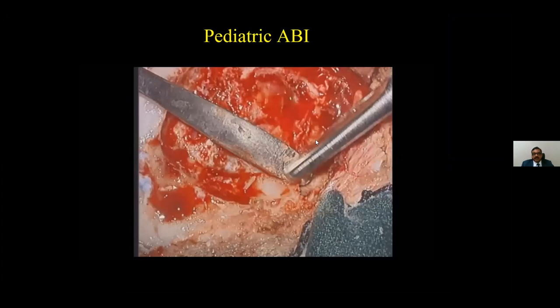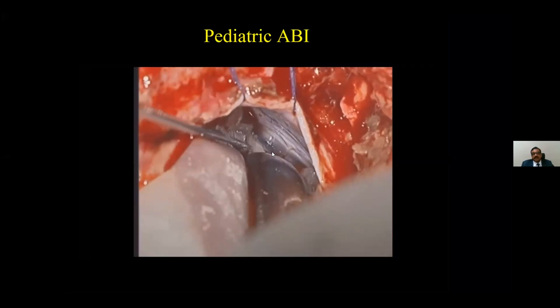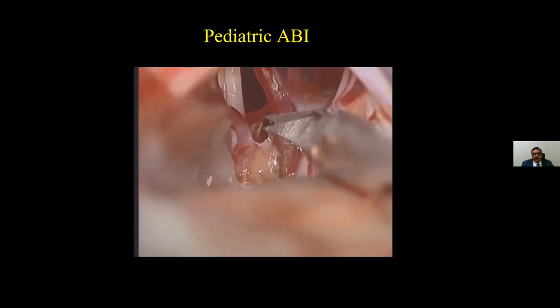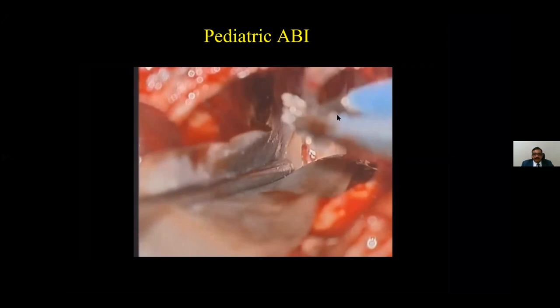And we open the dura, let out the CSF. We open the cisterns and allow the CSF to flow. And the moment the CSF flows out, the entire cerebellum will relax. You can see the choroid plexus and the arachnoid, which is out. And this is the 7th nerve, and the 9th nerve, and see here, the tenth nerve. So the ninth nerve is usually the guide. We follow the ninth nerve, and the ninth nerve will usually take you straight into the recess.